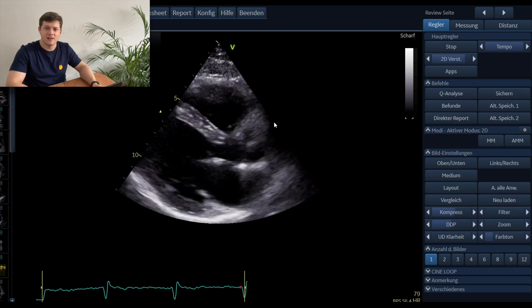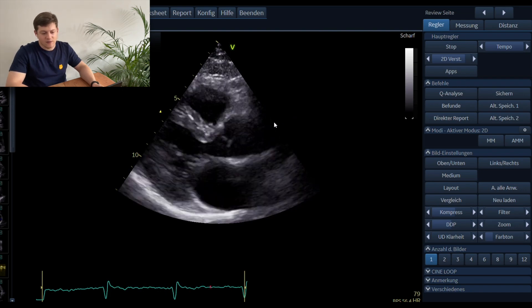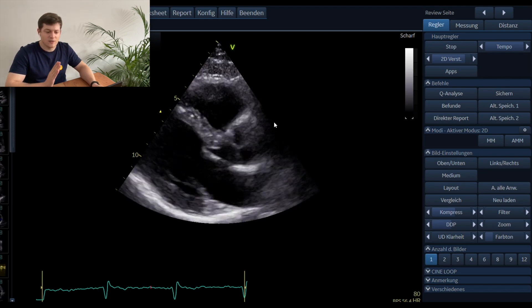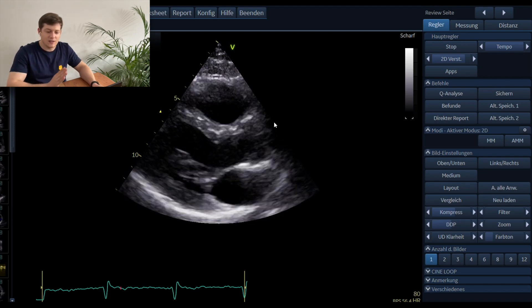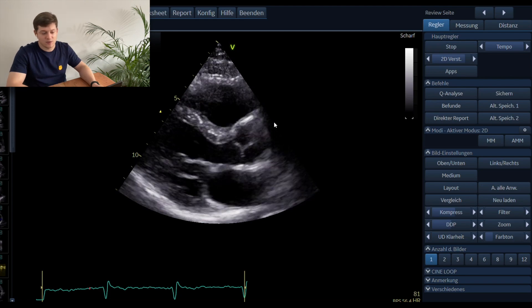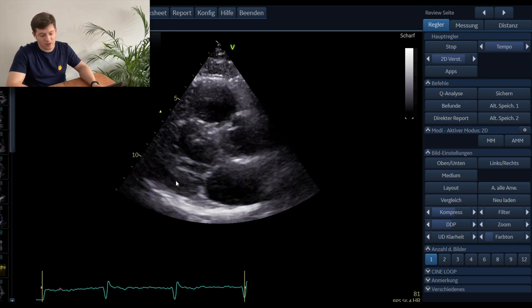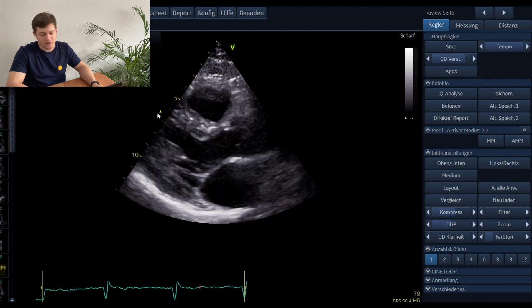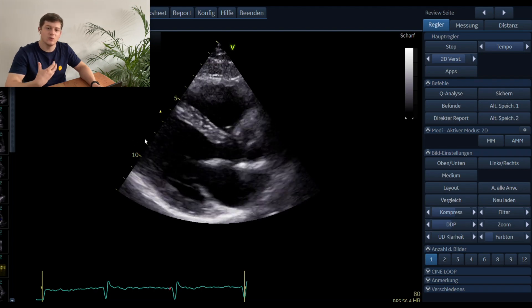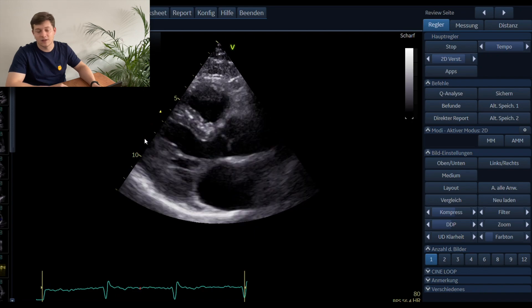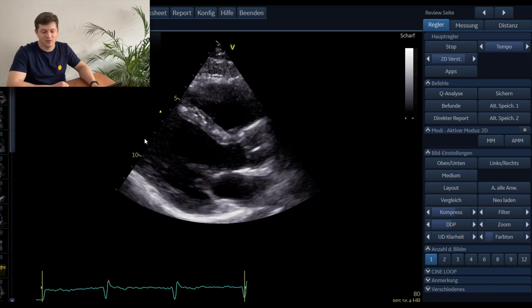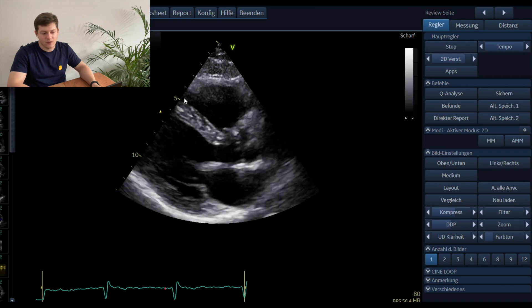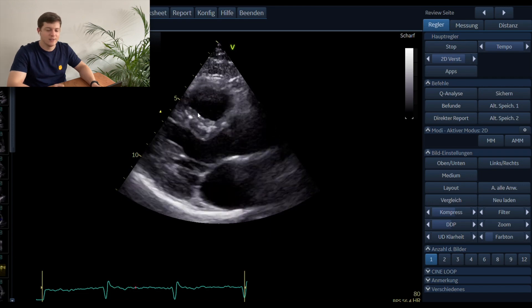To summarize, in this view you already get a lot of information about the anatomy — about the right ventricle, the left ventricle, and you can also appreciate left ventricular function in this region, though not the apex, because in this view you do not want to see the apex unless you choose an atypical view.